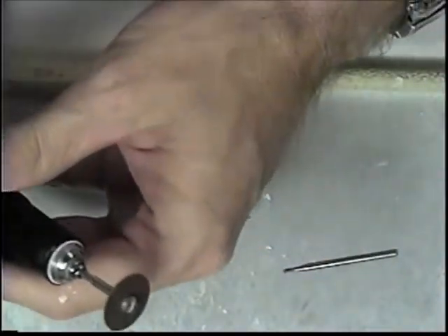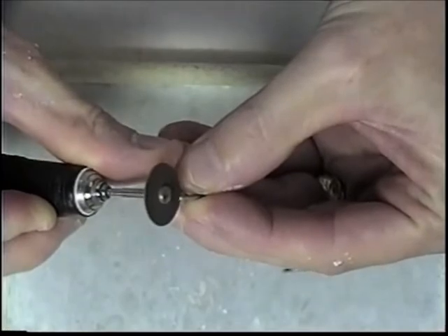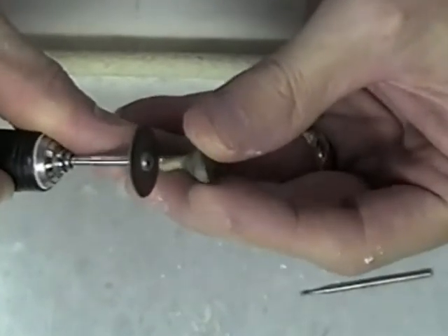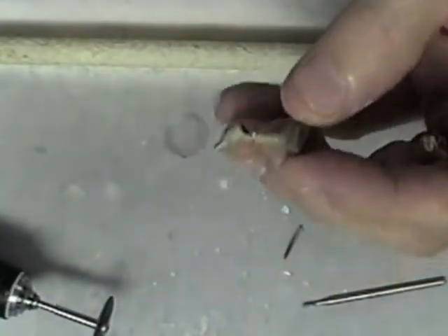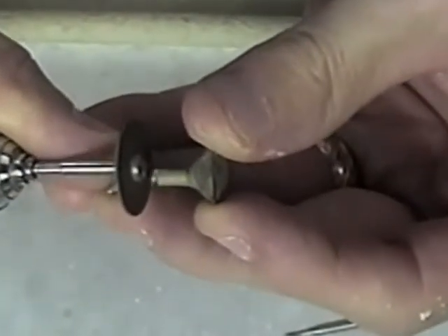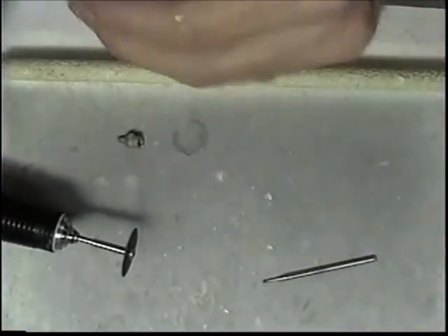So I'm going to start with my electric handpiece and just cut the sprues off. And now I will reduce the areas where the sprues were at.